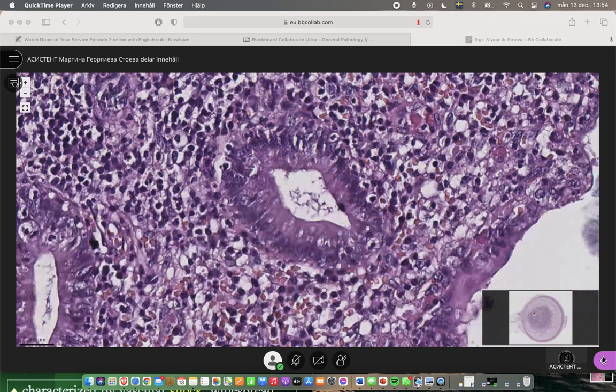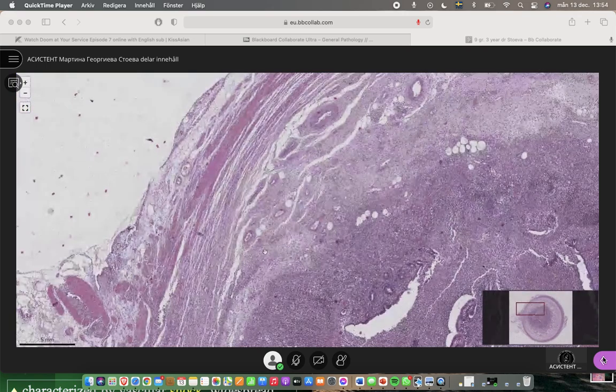Even here in some areas we can find inflammatory cells in between the epithelial ones. These are neutrophils, which is another evidence of severe acute infection. So this is the mucosal lining, actually only remnants of it. The next layer is submucosa, after it lamina muscularis propria, subserosa, and serosa is the outermost layer.